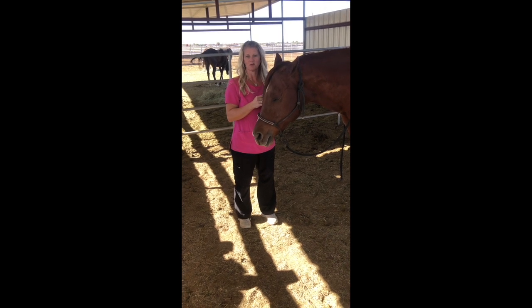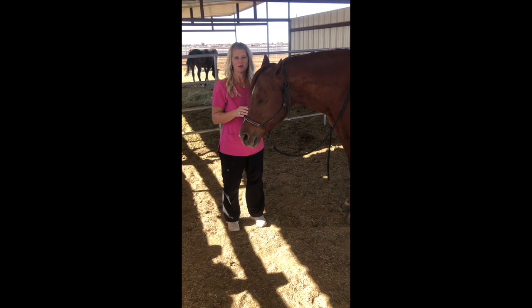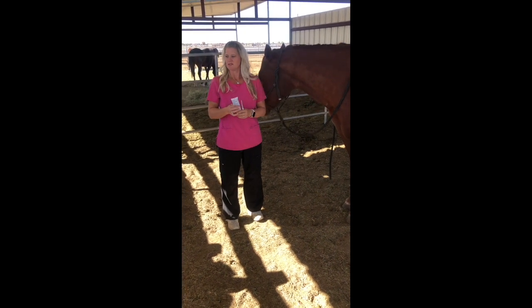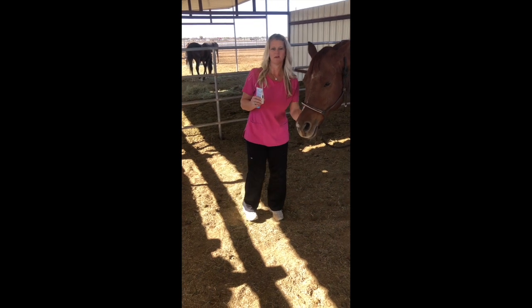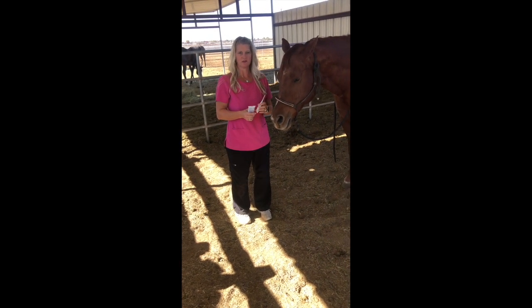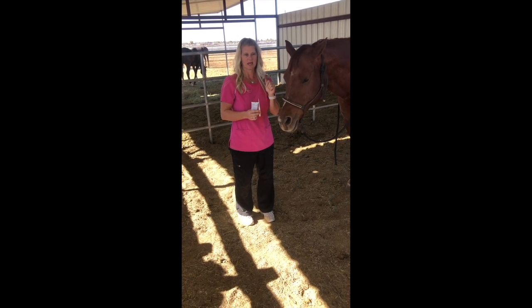Some horses actually run hot. They can have a temperature of 101 normally. So a good measure is to know where your horse is normally. So I recommend using a digital thermometer. You can get these at any place. You can get them at Walmart or CVS, Walgreens, pretty much anywhere. And I don't recommend using the thermometers with the mercury, the glass thermometers that can break.